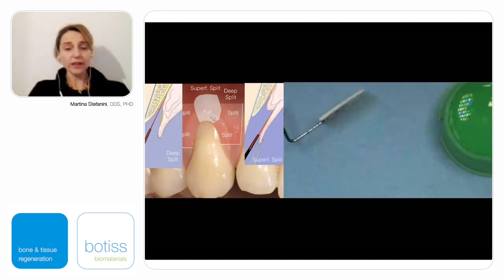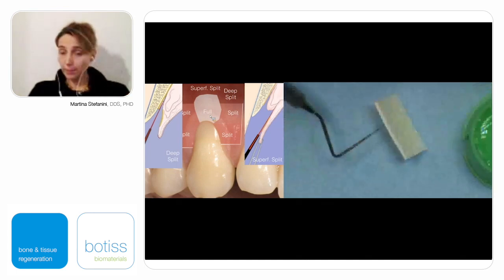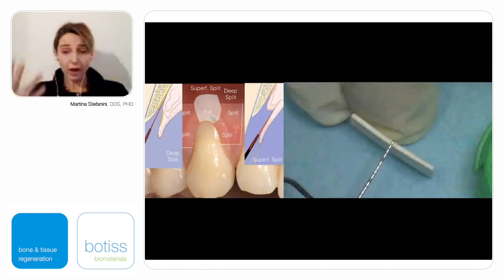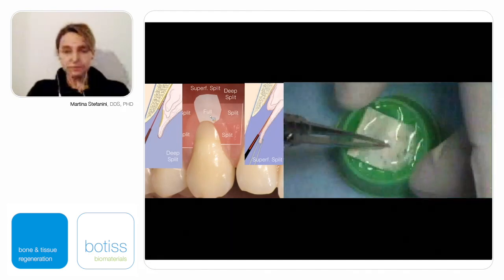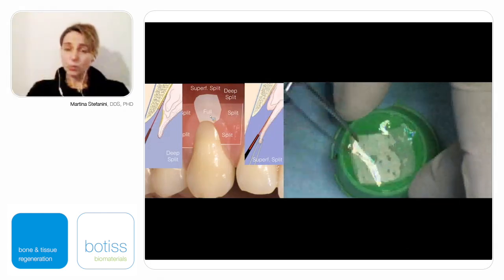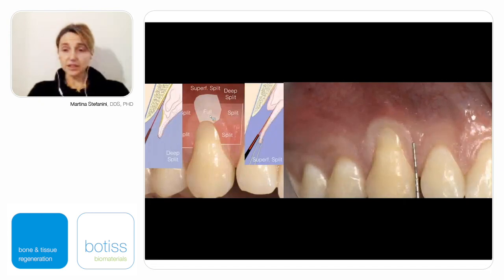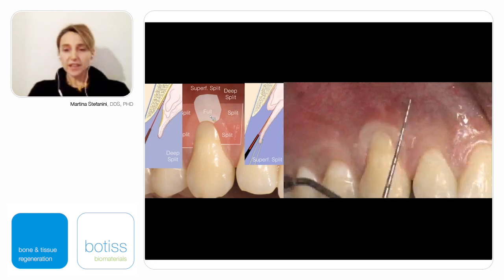You see, we have the right amount of keratinized tissue, so we can perform a coronally advanced flap that by itself will remain stable in the final position, but in order to obtain an increase in soft tissue, which is of paramount importance to avoid recurrence with time, we can use a collagen matrix. Before starting the surgery, it's better to open the Mucoderm and put it into saline, because we want to trim and fix it when it is already completely wet. Then we can start with our flap design.